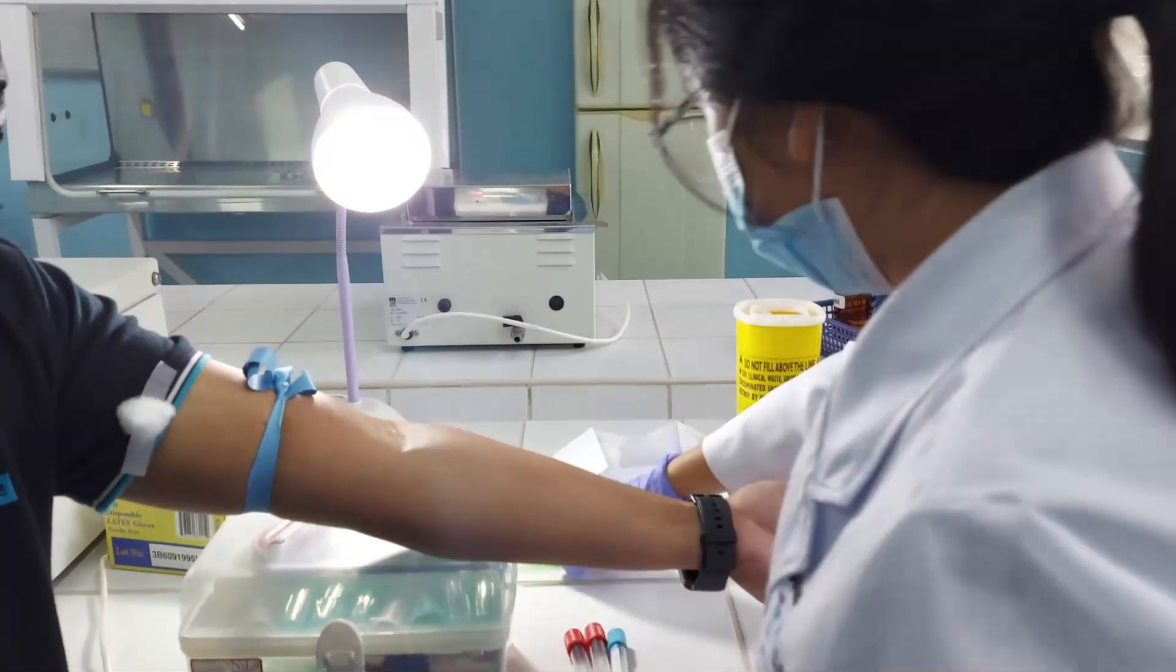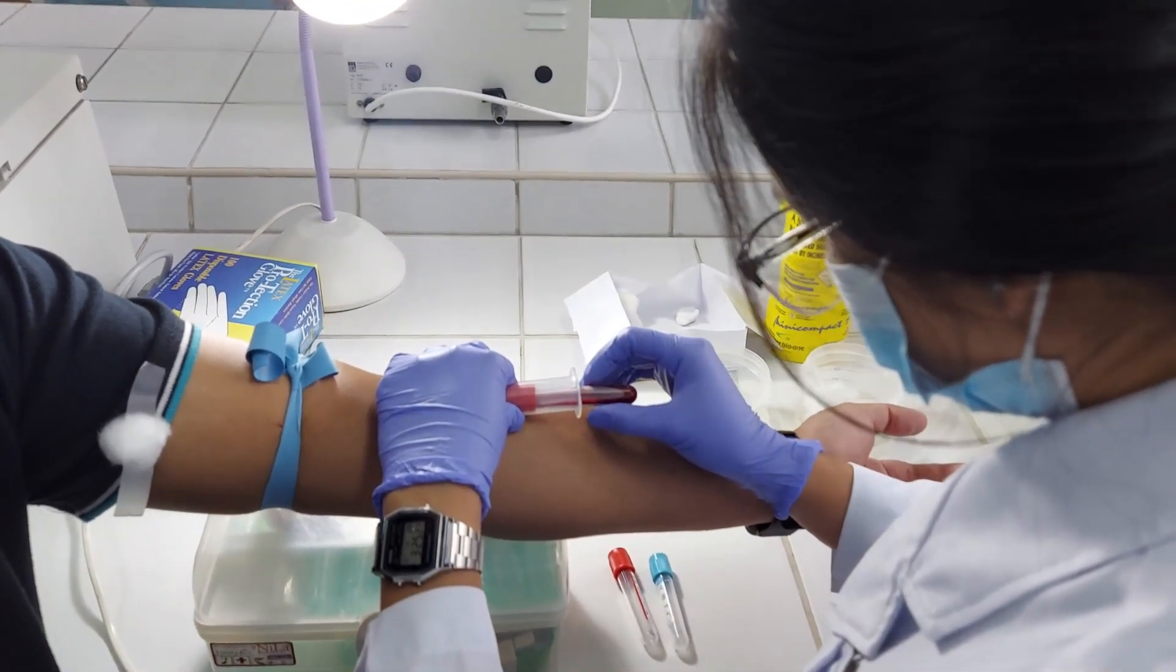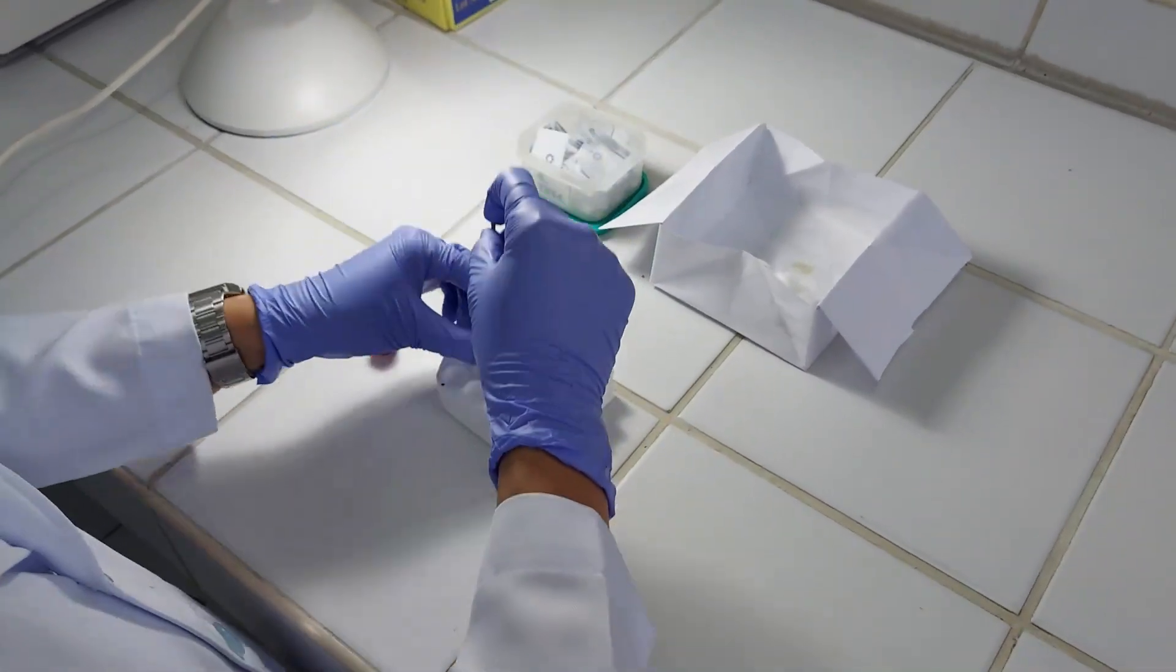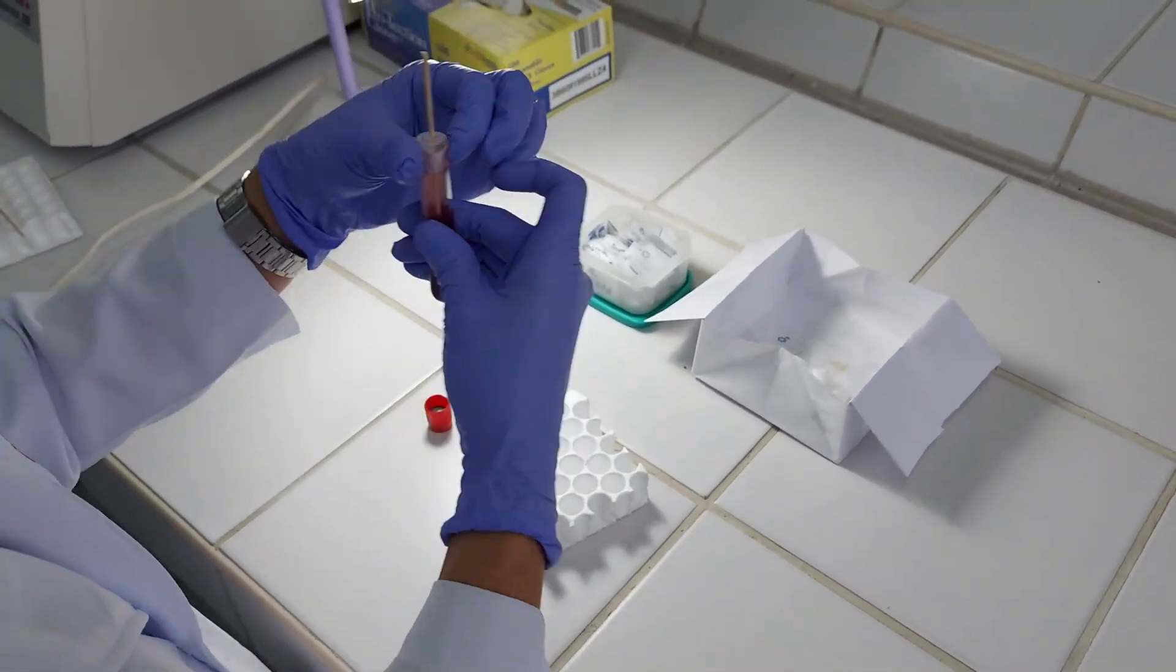For this method, you still have to collect 5 ml of non-anticoagulated whole blood using a red top tube. Place a coiled wire or an applicator stick into the tube and cover the test tube with a Nesco film.